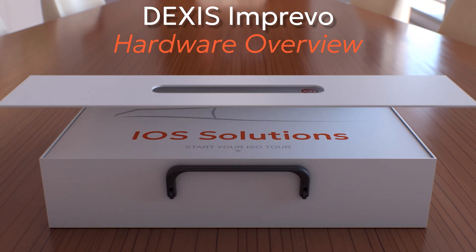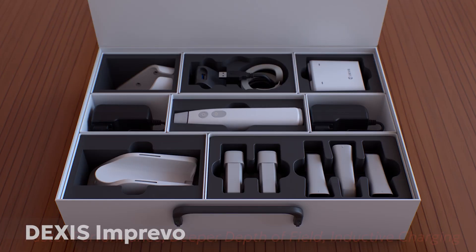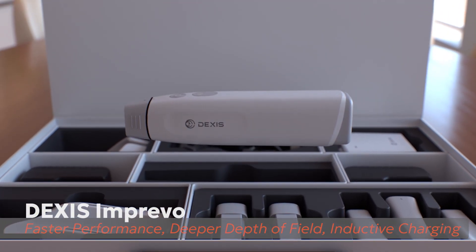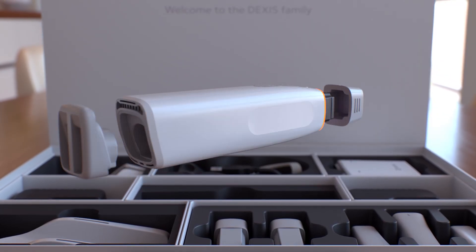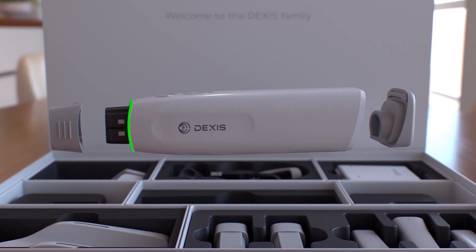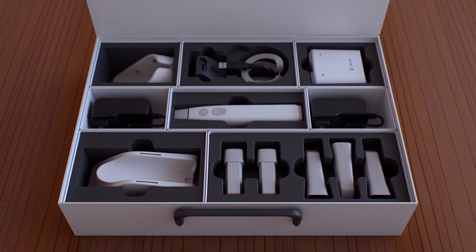Introducing the DEXIS Imprevo Intraoral Scanner, our next generation intraoral scanner offering faster performance, deeper depth of field, and enhanced shade matching when compared to previous DEXIS scanners, coupled with an ergonomic design with contactless inductive charging. The Imprevo scanner is our latest innovation in scanning technology for dental professionals globally, designed solely by DEXIS and powered by DEXIS IS ScanFlow 2.0. In this hardware overview, we'll take you through the key components included with your Imprevo scanner.